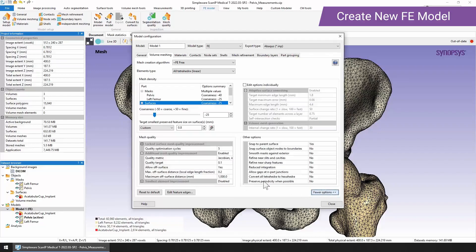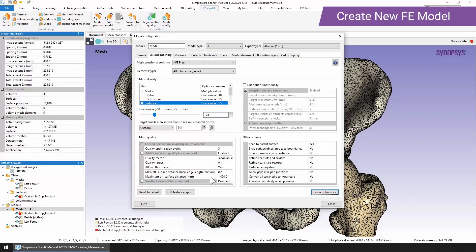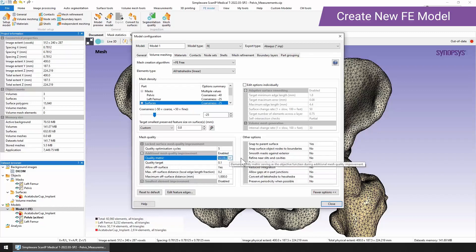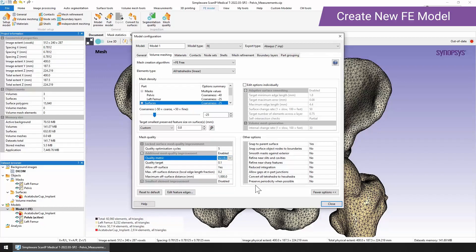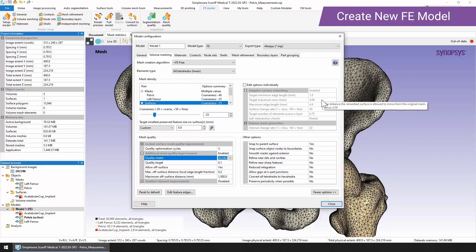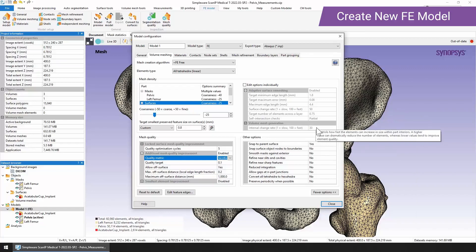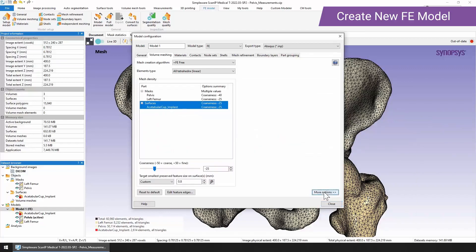Now again, there are a lot more options that you can explore, lots of things on the additional mesh quality improvement. So targets and metrics that you can work with. At the moment we're using Jacobian in-out ratio and edge length ratio to kind of optimize the mesh after it's been initially generated. You can also see targets for minimum edge length, maximum edge length, change rates, intersection checks. All sorts of things here. Again, I would initially just look at the kind of simple view, try a few models using the defaults and then if you need to access those options.